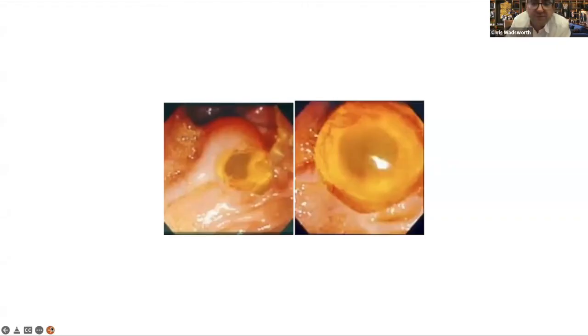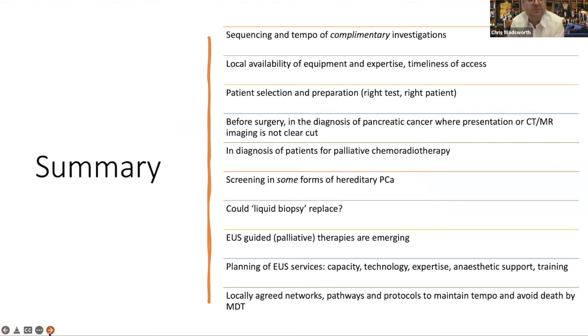And I'm just going to finish up because I'm an endoscopist with not an ultrasound picture, but an endoscopic picture from the patient illustrated in those previous EUS pictures. And this is a beautiful example of a fisheye appearance of the papilla with a distended papillary orifice with mucin extruding from it, and I'm sure I can convince you it looks a bit like a fisheye.